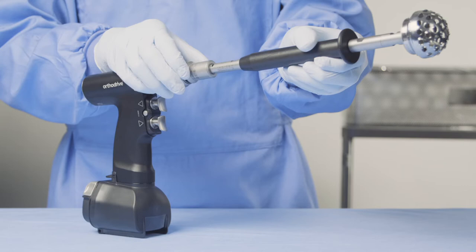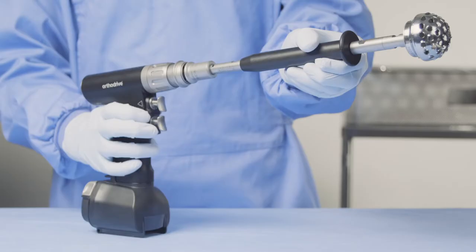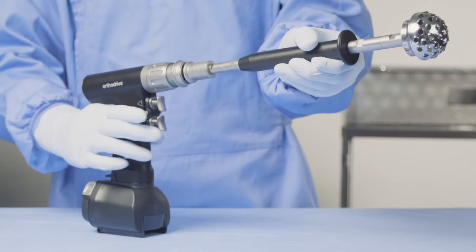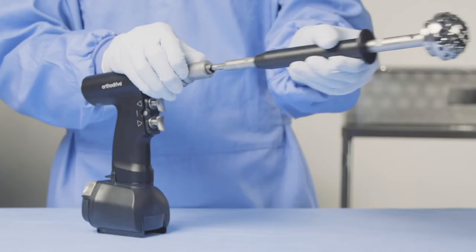You can now take the tool off safe mode and place it into high speed drilling mode. You then depress the trigger to run the reaming handle. To remove the reaming handle, simply pull back on the Hudson collar and slide it straight out.